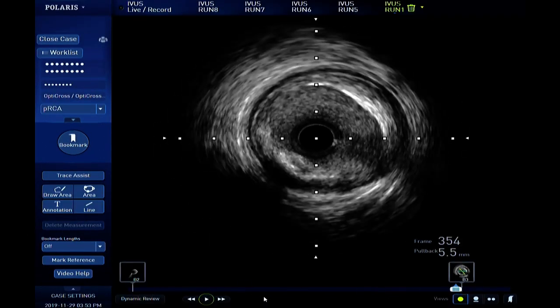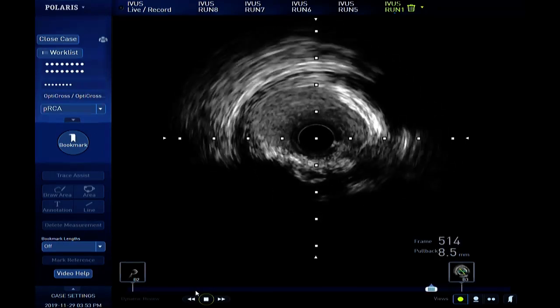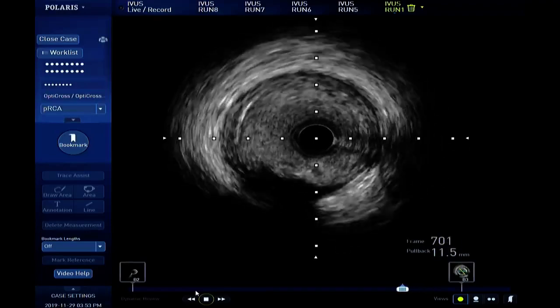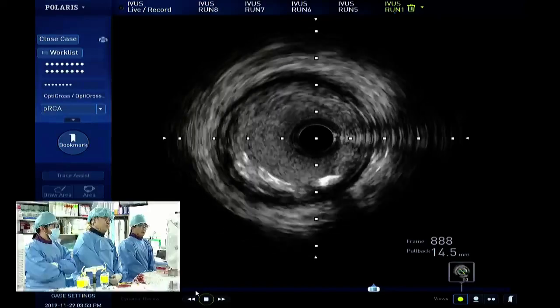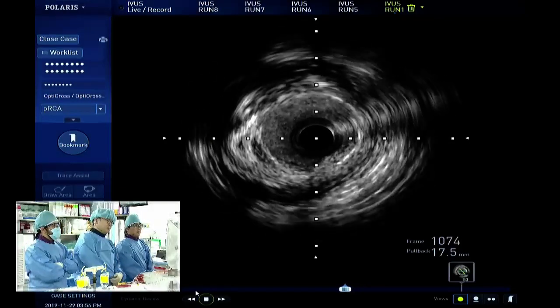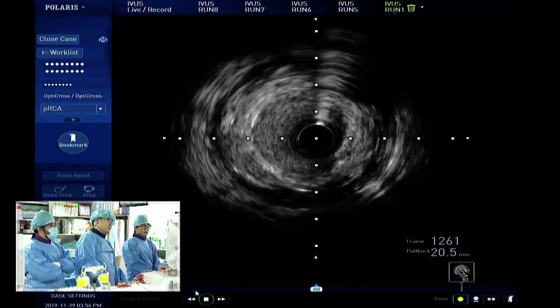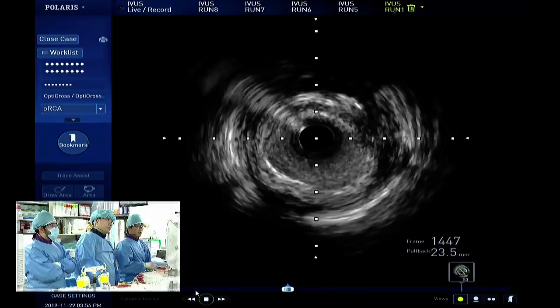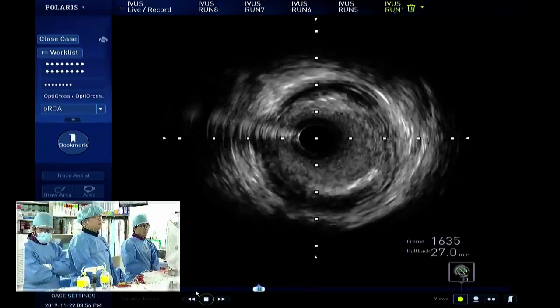Distal first. IVUS. Okay, this is the pre-IVUS. If you look at the baseline RCA, I thought there is a landing zone at the mid portion of the RCA where the RV branch is. And this is a potential distal stenting area. The vessel size is about 5.0, very big. This part is almost a 5.5 vessel. Lots of plaque, superficial calcium there, and a little bit of negative remodeling at the bending portion here.